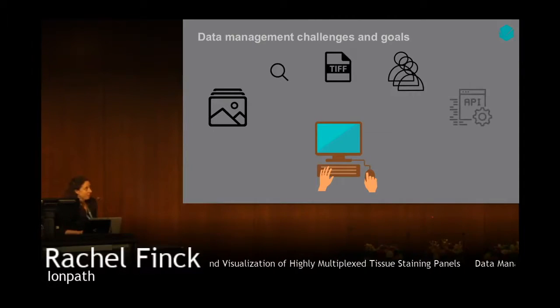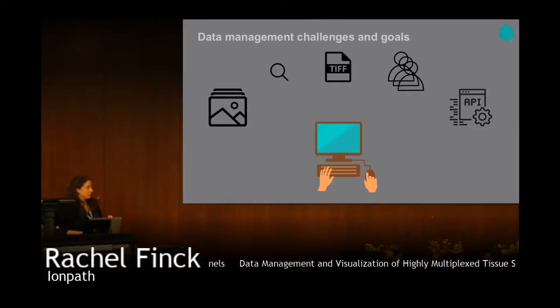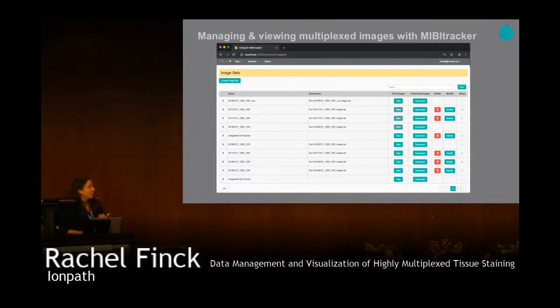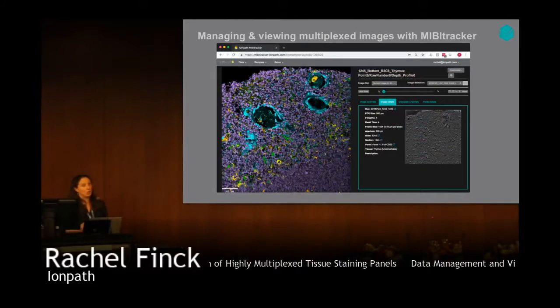We also want to do this in a modular and open way, so that if you want to integrate with other types of analyses, more advanced analyses that we're developing later on, or analyses that you develop, you want to throw some QPath segmentation into the middle, you can integrate and do that too. I'm going to show a couple of quick screenshots to orient you to the type of simple web application that I'm talking about, being able to list and search for things, and of course also being able to look at the data itself.